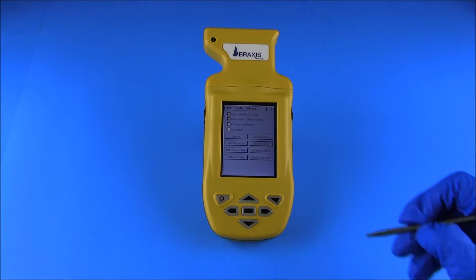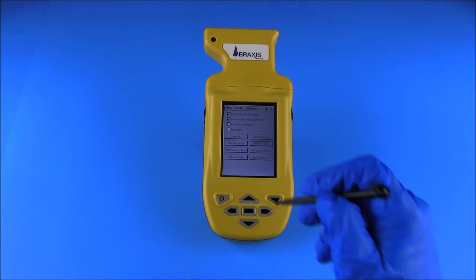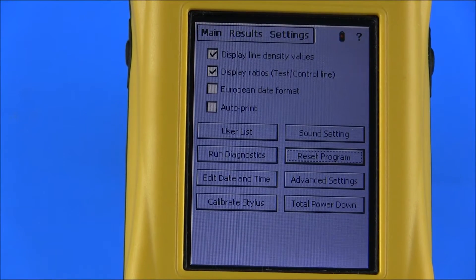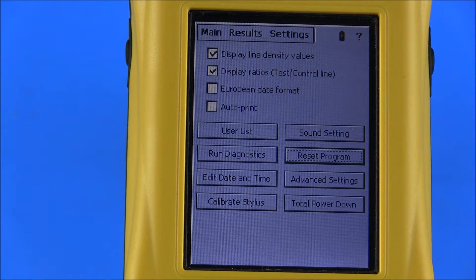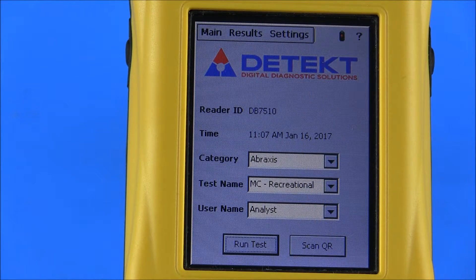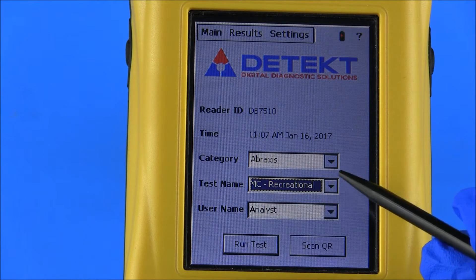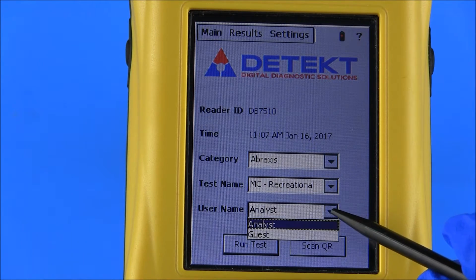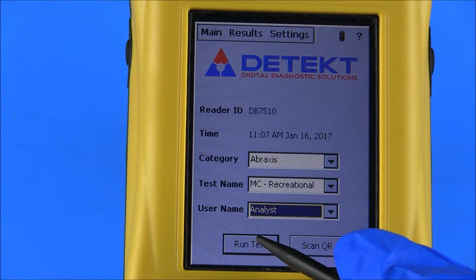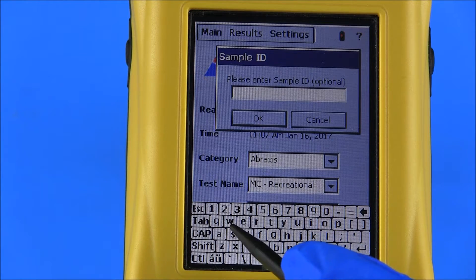To use the AbraScan reader to interpret test strips, select the main tab from the User Control menu. This will open the main menu screen displaying the reader ID, time and date, as well as the drop-down boxes for the category, test name, and user name. Using the drop-down menu for each field, select the appropriate test type from the test name box and, if multiple users are entered into the reader, the appropriate user name. Select Run Test. If desired, a sample ID can be added to uniquely identify the test or the field may be left blank. Select OK.